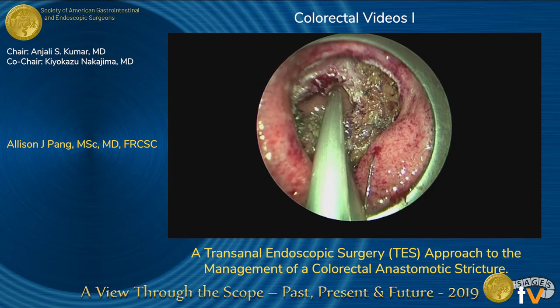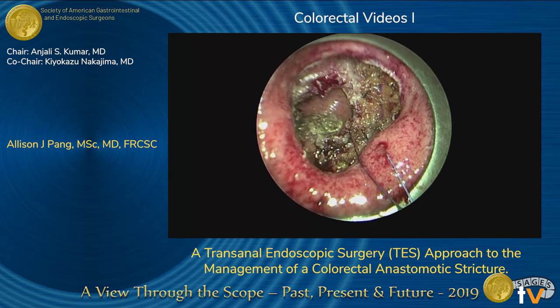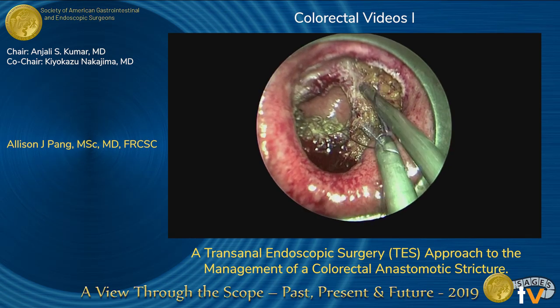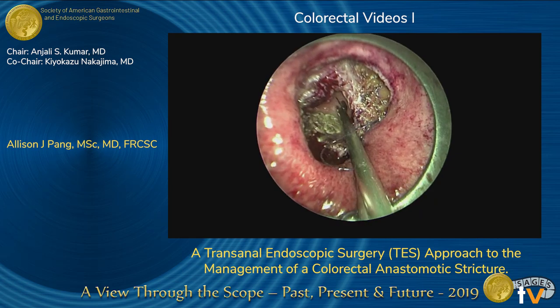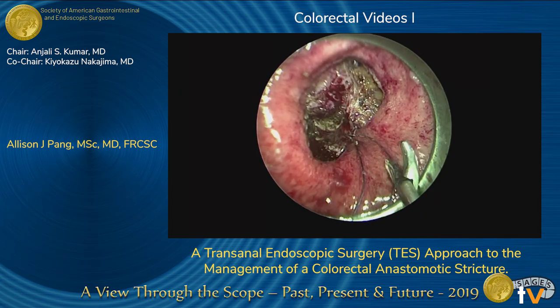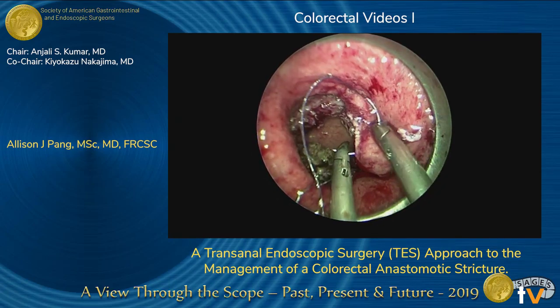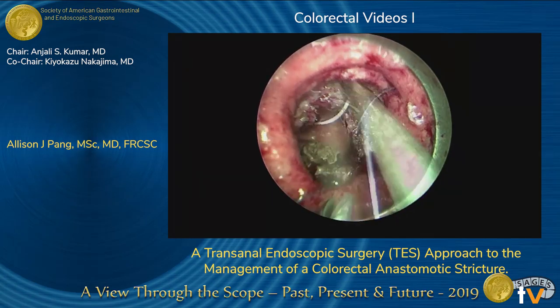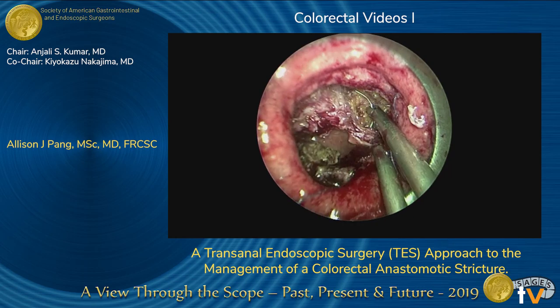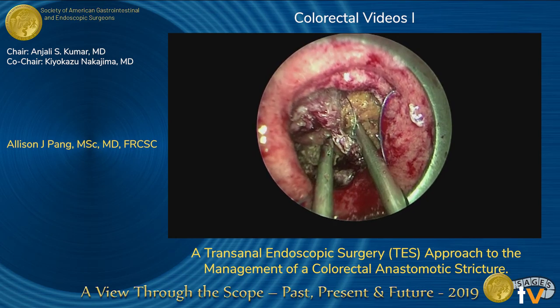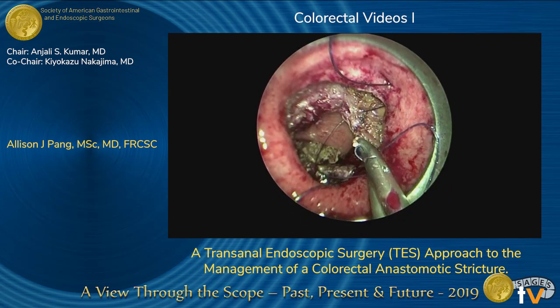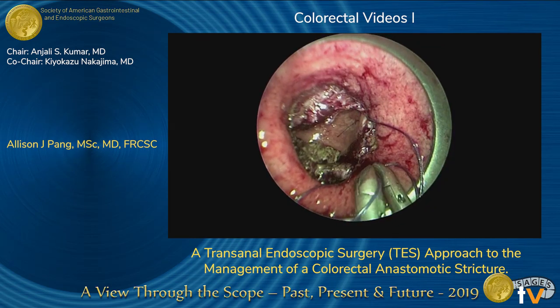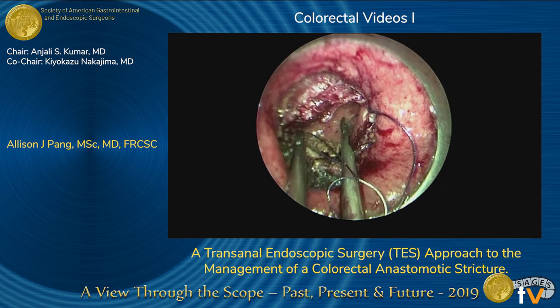For the reconstruction, everything was done trans-anally. We first placed cardinal sutures using three Vicryl sutures, then re-approximated all of the gaps using interrupted sutures. As you can see, it can be quite challenging to place multiple interrupted sutures through a transanal platform. We could have done the reconstruction with a running suture, but we felt that interrupted sutures offered the best chance at a tension-free anastomosis. In the end, we were indeed able to complete a tension-free intra-rectal anastomosis.